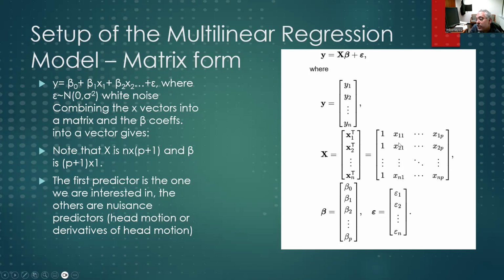And then starting with this very next column, this would be that predicted time series, the perfect model, sampled, digitized to be sampled at the same rate as the actual acquired bold signal for that voxel. You just put that there. If you do nothing but include these two columns, that would be good enough. You could do the general linear regression and figure out beta.